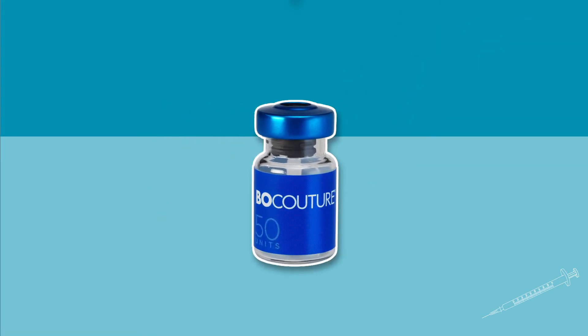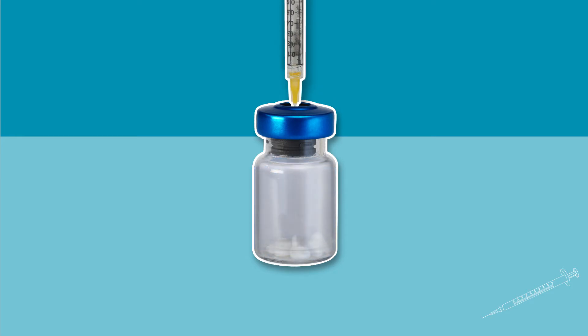Insert the needle vertically through the rubber stopper. Add the sodium chloride solution to the BocaTure vial gently, avoiding foam formation. If the vacuum does not pull the solvent into the BocaTure vial, the vial must be discarded.